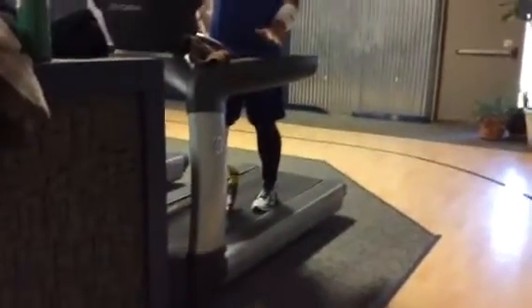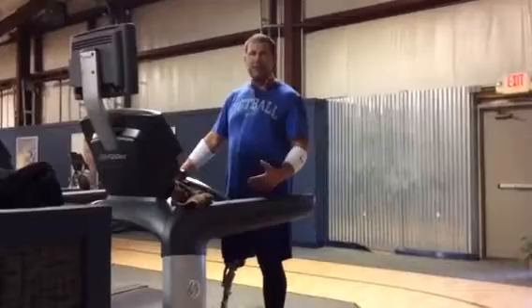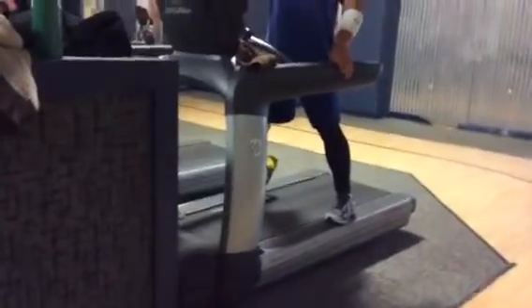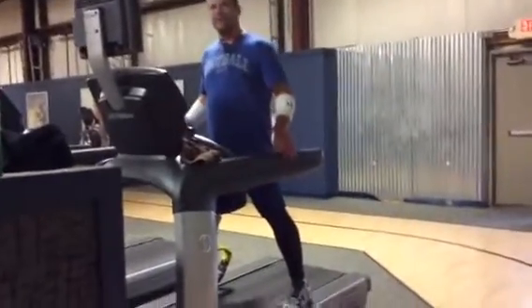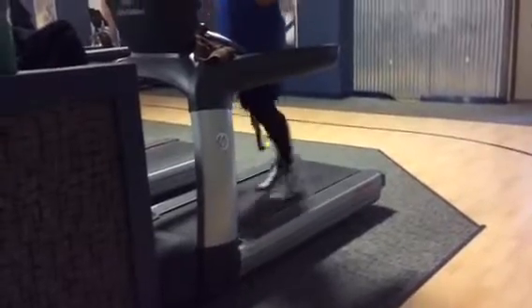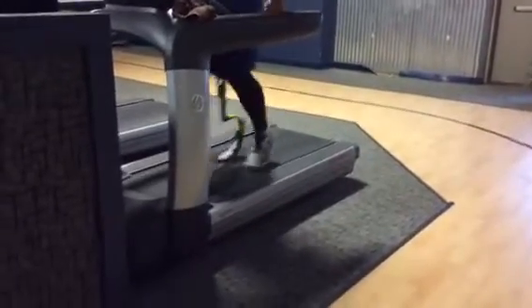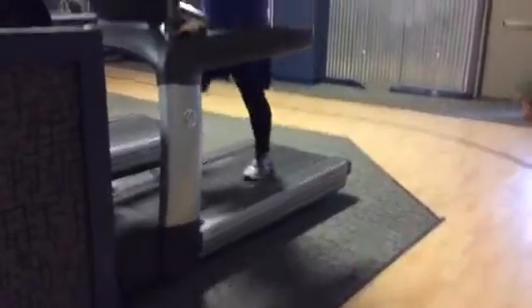As you start to build up stamina, you can go for like 30 seconds at a time and then walk. And then go another 30 seconds and then walk for a couple minutes. So we're going to see what that looks like. I've got it right now at about 3.5 miles an hour. And then take the speed down a little bit. And then walk. Then you can go for another 30 seconds. And then walk.